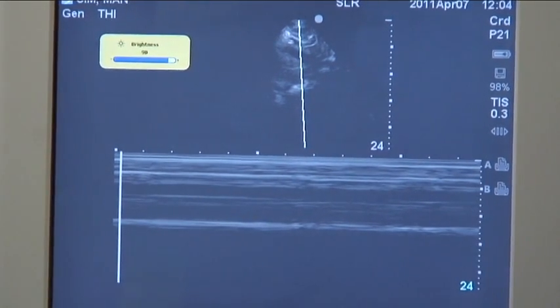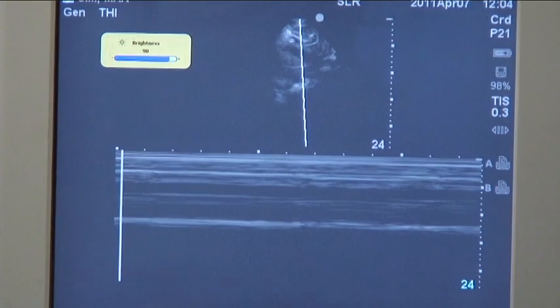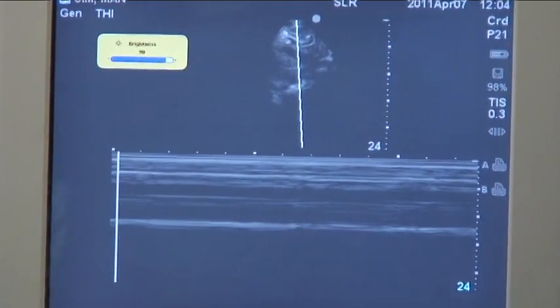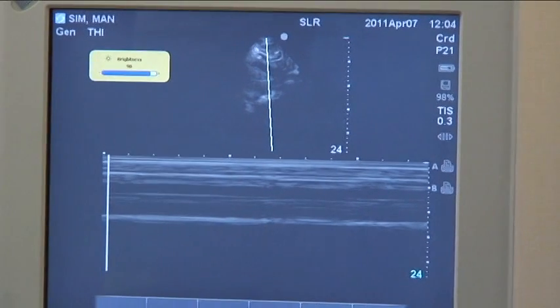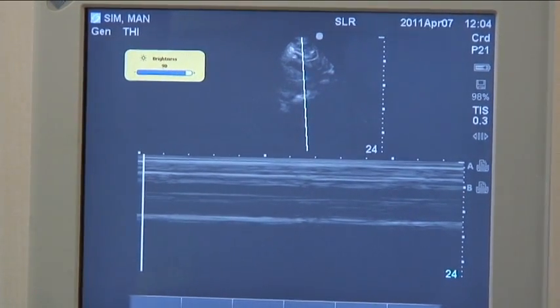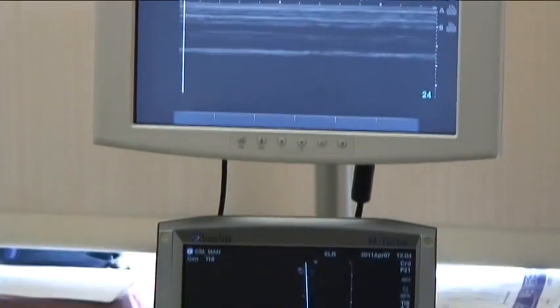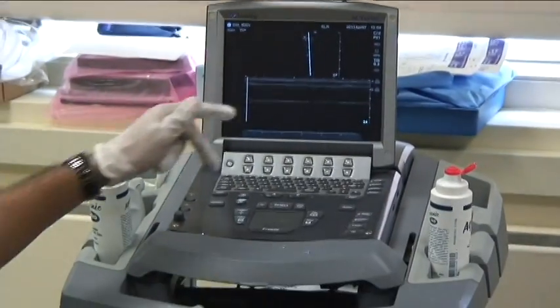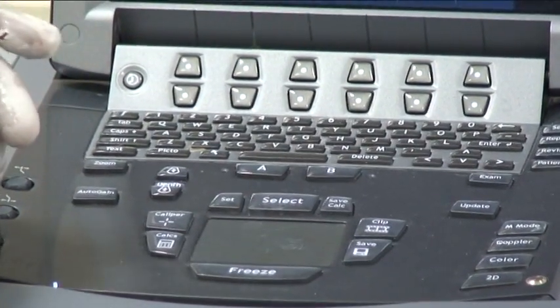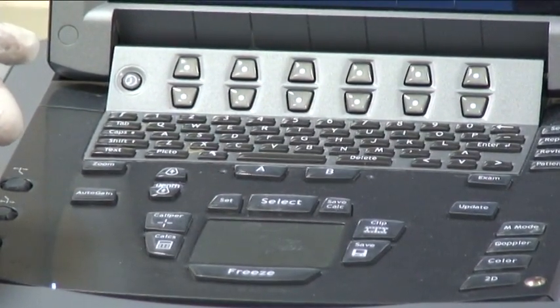Now you want to measure the IVC in inspiration and expiration. And basically what we're talking about is the compressibility or the variability with respiration, which indicates fluid responsiveness. Now, just to look at this machine here, you have the caliper button, you have the select button, and you have the freeze button that we use to freeze it in M mode.